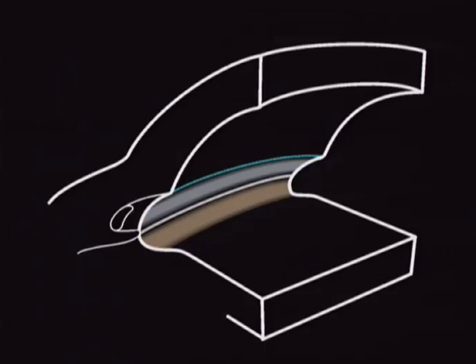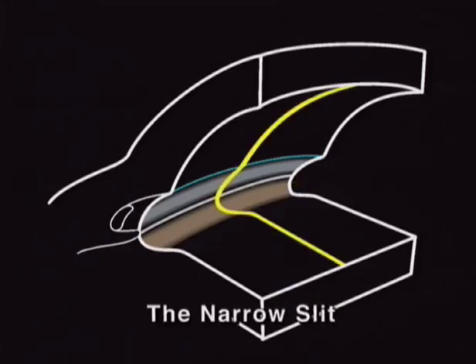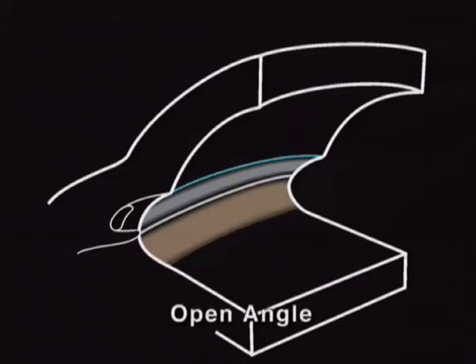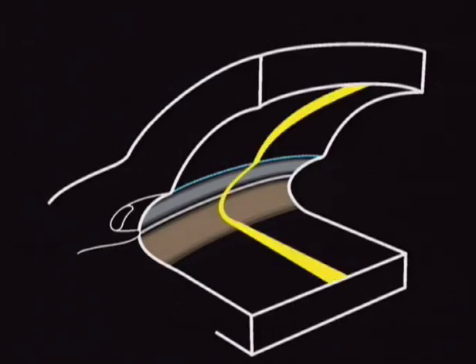That is, whether we can reach Schwalbe's line, Schlemm's area, the scleral spur, the ciliary body band. The second criterion is the shape of the narrow slit light, whereby we evaluate its continuity in length and a continuous change in width. In case of an open angle, all anatomical parts are visible, and the light slit is continuous in length and width.